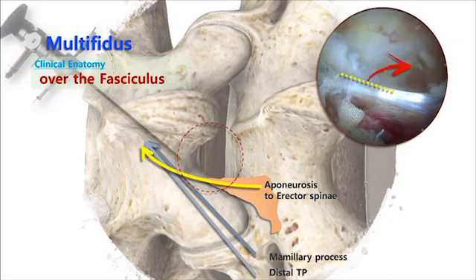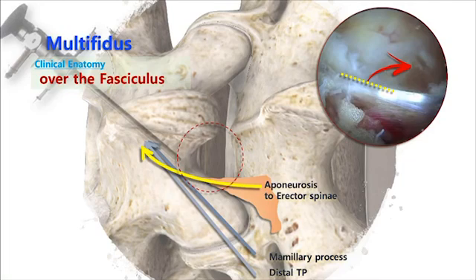This fibrous band is the multifidus. It originates from the mammillary process and transverse process and inserts into the dorsal border of the lamina. The clinical meaning is that you should run and go over the fasciculus to enter the spinal canal — don't try to remove this fasciculus, and don't remove muscle fibers on the lamina excessively.